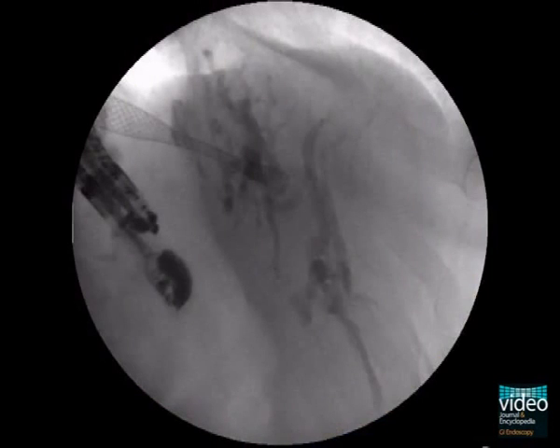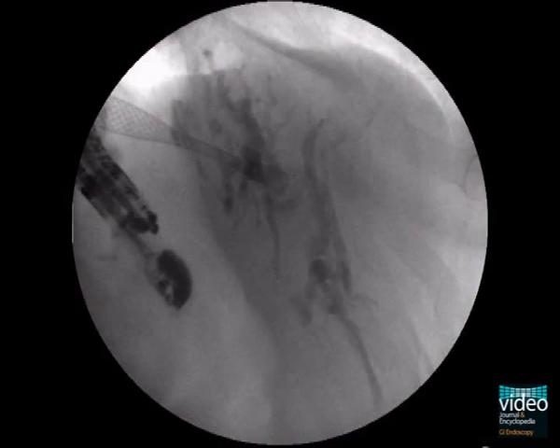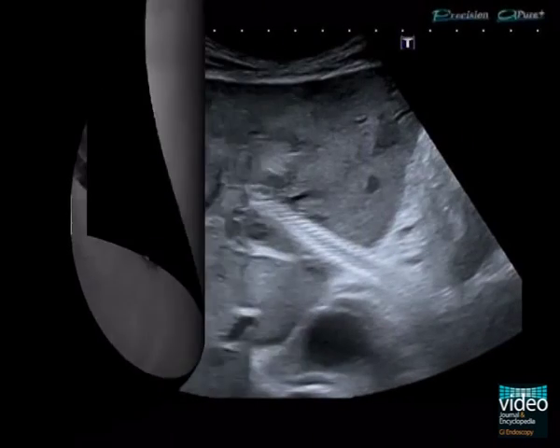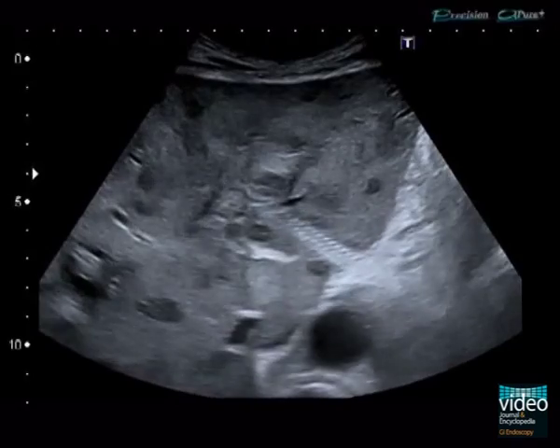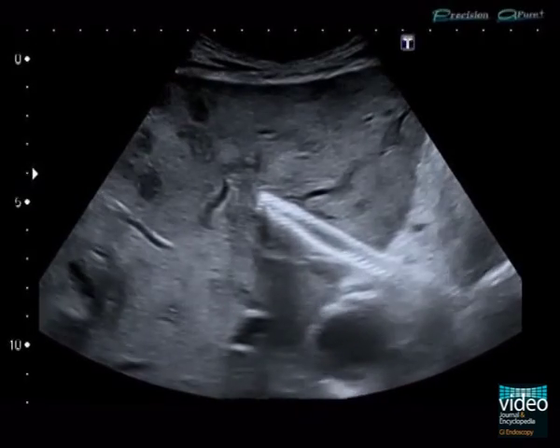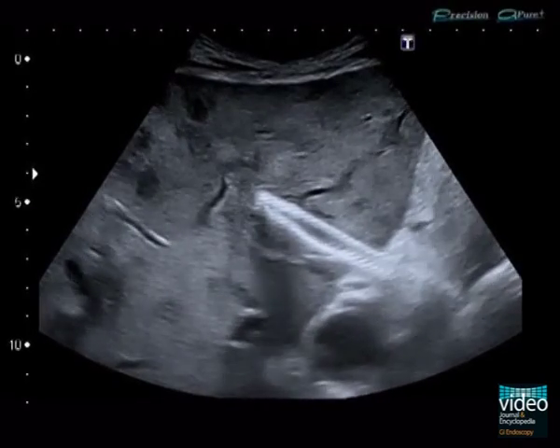After complete stent delivery, the effusion of bile and pus demonstrates and provides evidence for the correct position of the stent. To prevent stent dislocation, the stent can be fixed with haemoclips at the intragastric mucosal site. Further control fluoroscopy shows the correct stent position and the effusion of contrast media into the stomach can be seen.